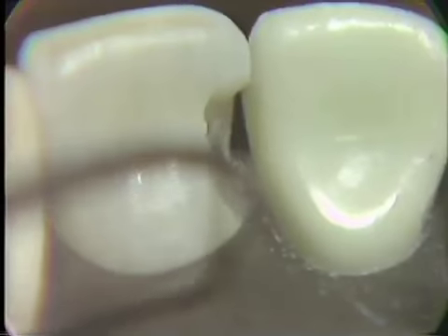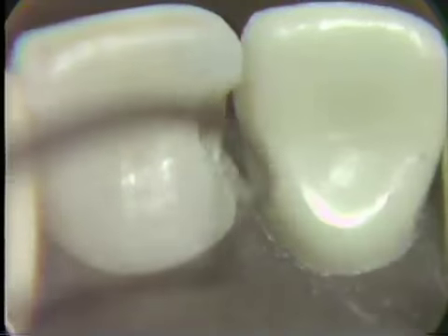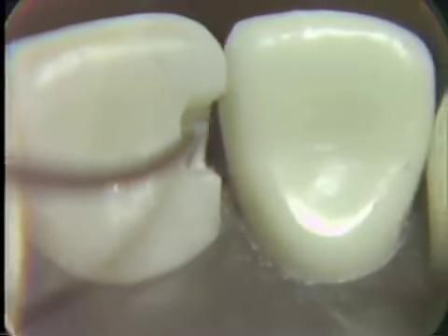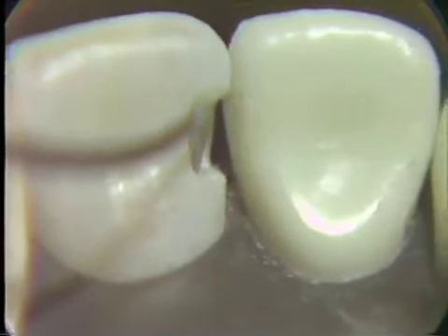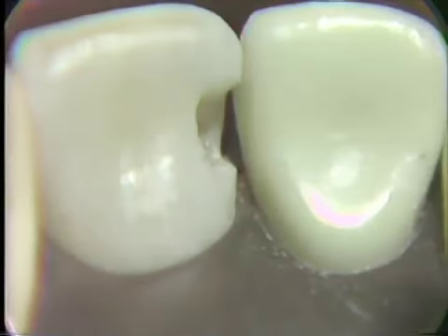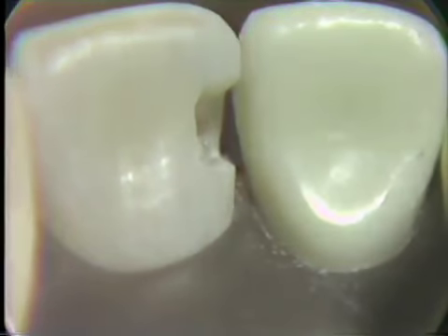Now we'll use the explorer to check the retention into that area, and again in the cervical position, a minor retention here and more major retention back in the lingual position. The outline form then is completed, and we have the retention placed within the preparation. We can then refer back to the criteria for the cavity preparation.